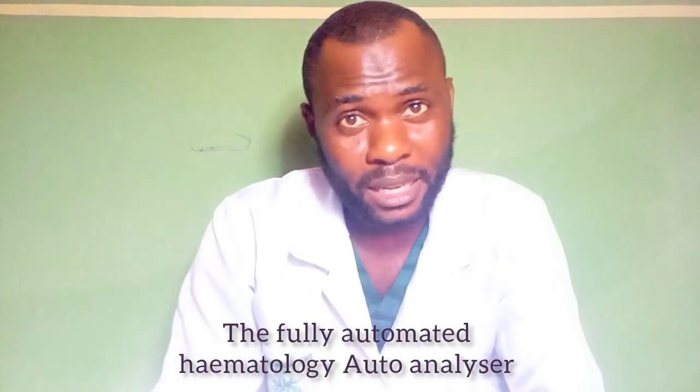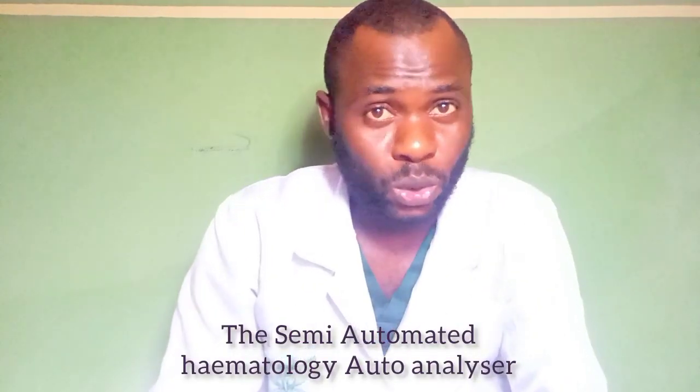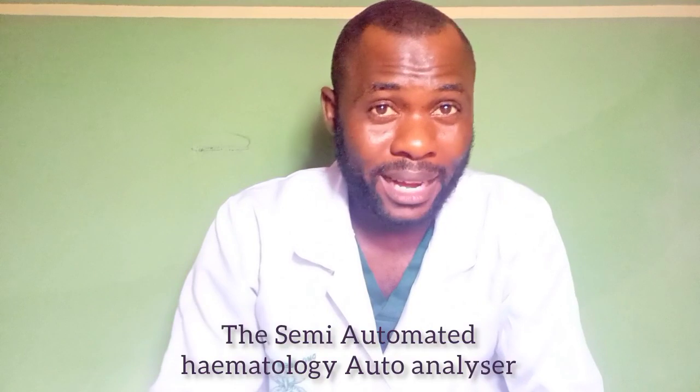What are the types of hematology auto analyzer? Basically, there are two types of hematology auto analyzer or the full blood count machine. That is the fully automated hematology auto analyzer or the semi-automated hematology auto analyzer.